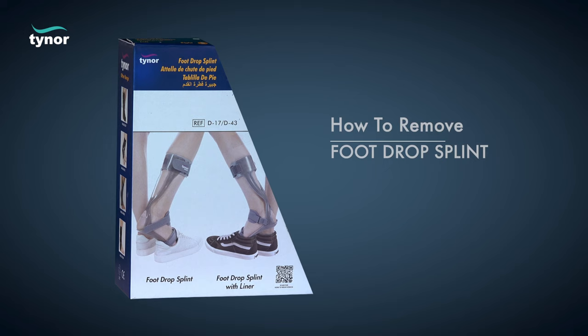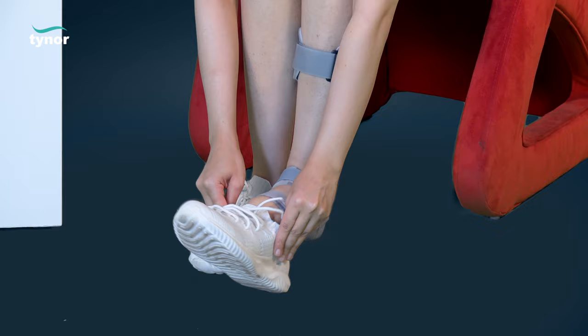Now let us see how to remove the foot drop splint. Unfasten the hook loop fasteners.